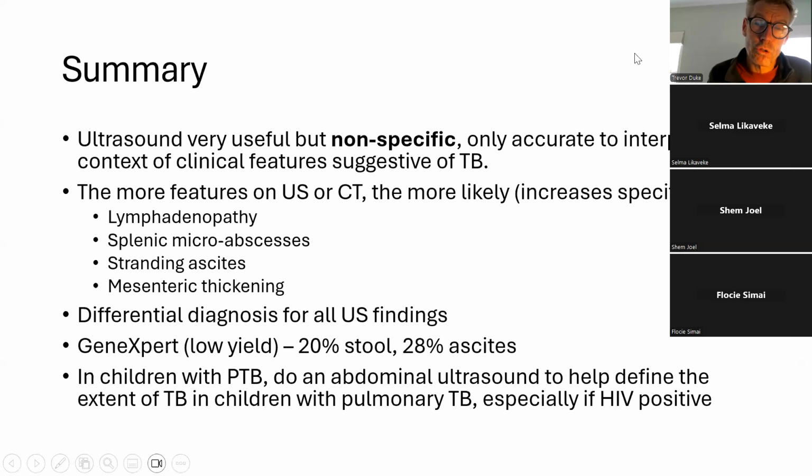That's most of what I wanted to talk about today, to start with some of the terminology of ultrasound, so we can build up an understanding of ultrasound, both when we're reading reports and also when we are learning to do ultrasound ourselves. And to explain some of the features, I think ultrasound is particularly useful for some pathologies within tuberculosis, and abdominal TB is probably the most useful. Of course, pericardial TB, it's also a useful modality of investigation.